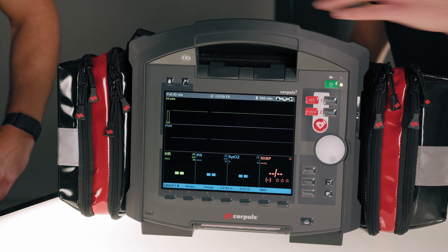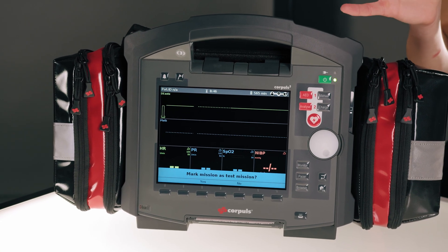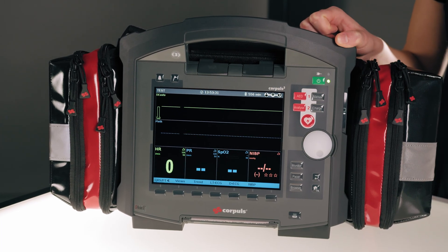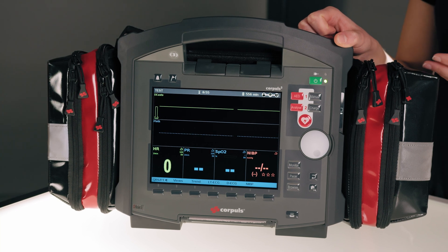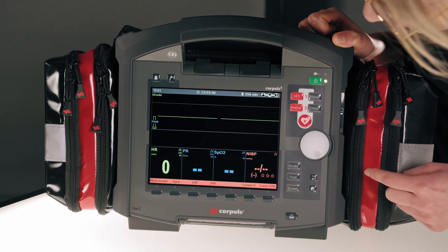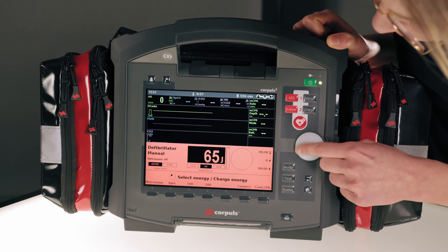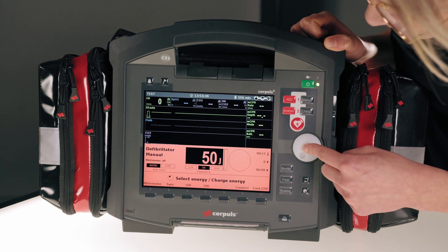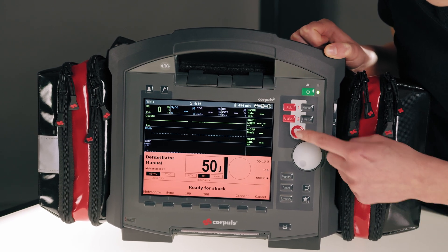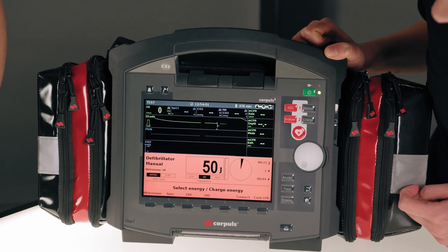To do so, we connect it to the therapy socket at the back. The device then asks whether you want to mark this use as a test — we press yes. In order to then select the energy, we manually select and perform rhythm analysis, and we reduce the energy to 50 joules. Confirm by pressing load and deliver the shock. No error message appears on the display, meaning the test was carried out successfully.